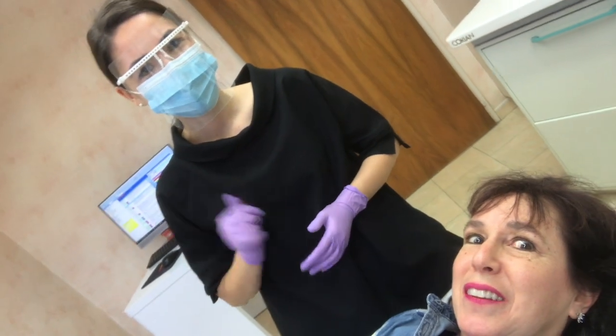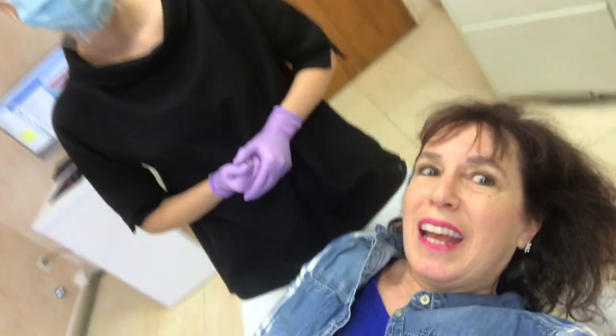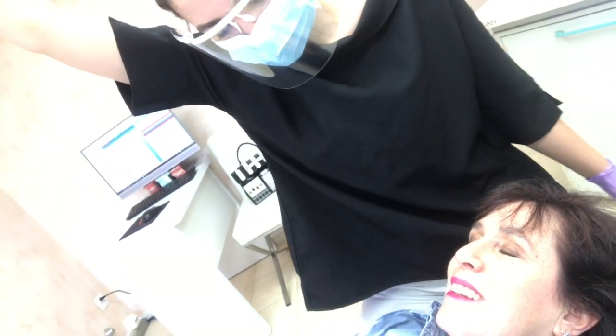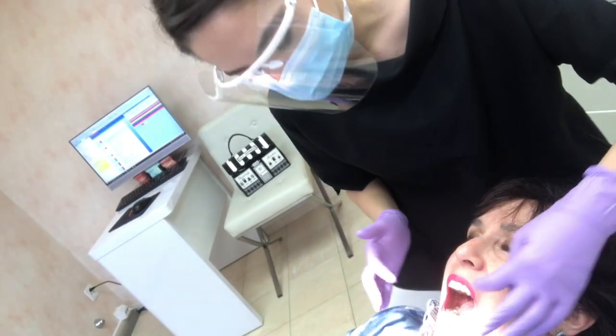So here we are again with Dr. Joanna Piescu. I think I have aligners number 9 on and she thinks I have aligners number 10, so we're going to check that because there's a little number on it. Exactly, we can definitely see the number of your aligners.